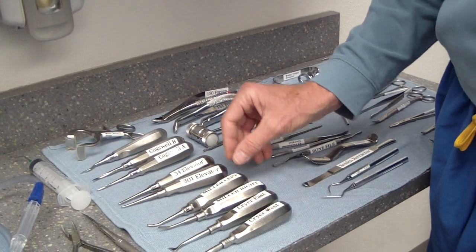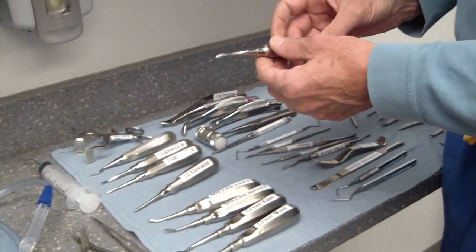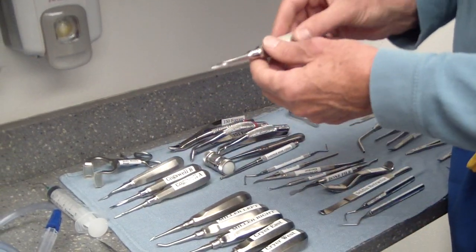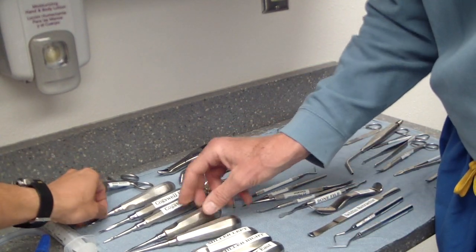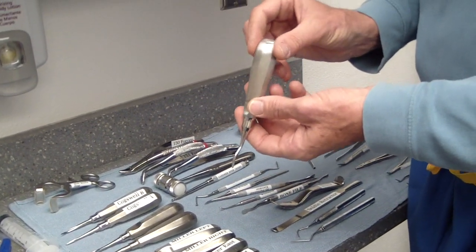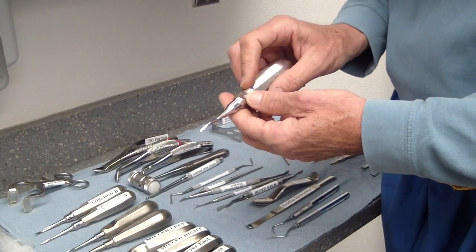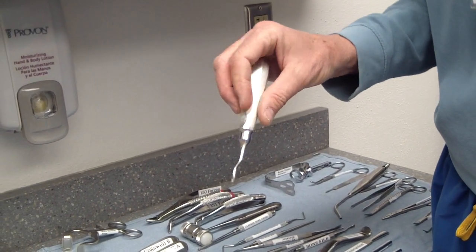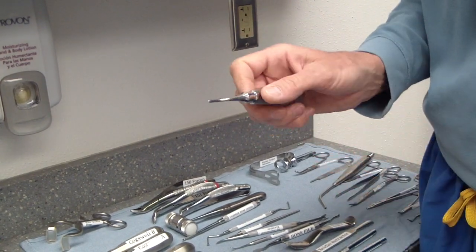For elevators, we generally start with the smallest — our 301 — and once you work it between the tooth and get a little luxation, you get a bigger area. You can use the 34 elevator to expand that and get more luxation. The 77 elevator was introduced by our Canadian colleagues and has become very popular with residents and staff. It has a little curved end, and for certain areas — upper maxillary thirds especially — it's a very convenient instrument with a lot of dexterity.